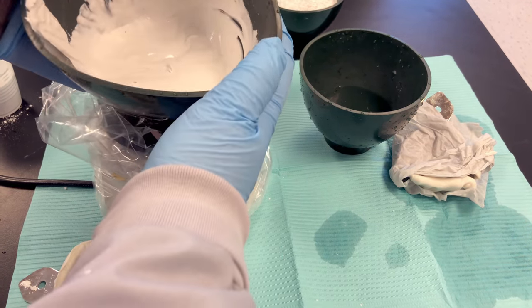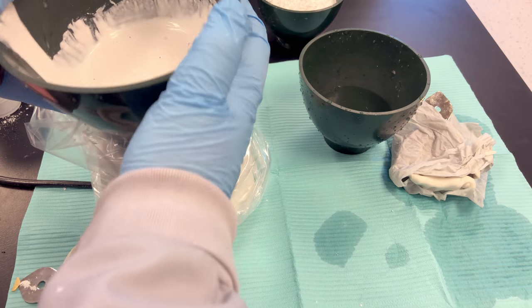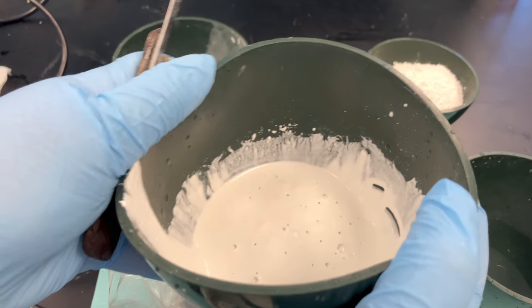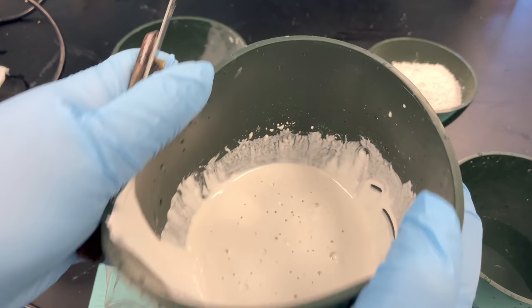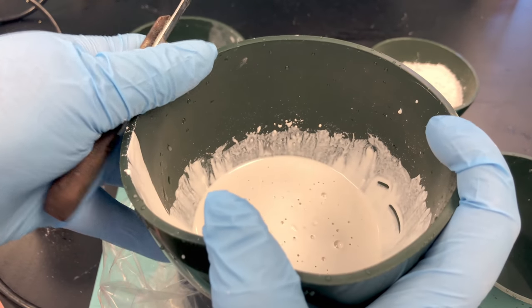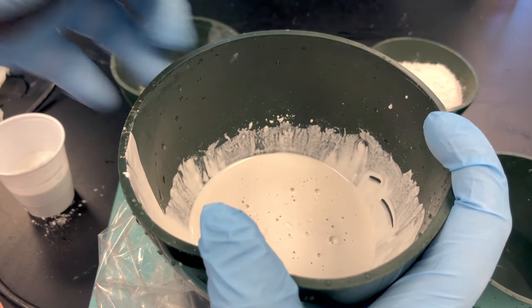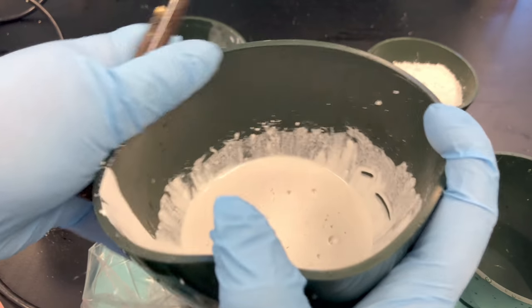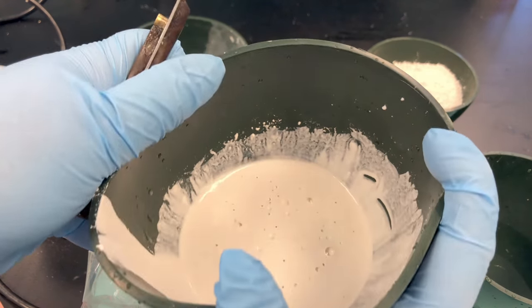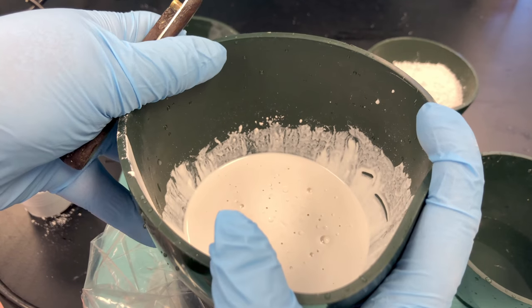Turn on your plaster vibrator. I like to tap the bowl up and down on the plaster vibrator, using pressure on the bowl — physically pushing the bowl against the vibrator so the bubbles rise to the surface. Once you start vibrating, don't re-stir your mix because you'll just stir air back into it. Once you get the majority of the bubbles up to the surface, we can start loading our impressions.